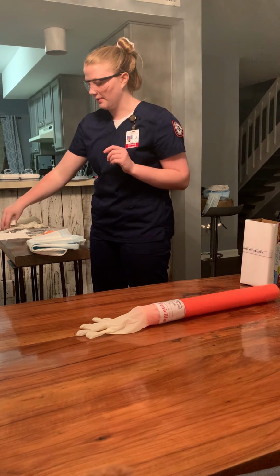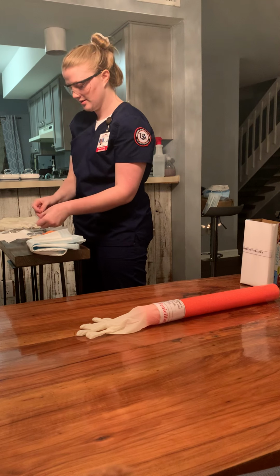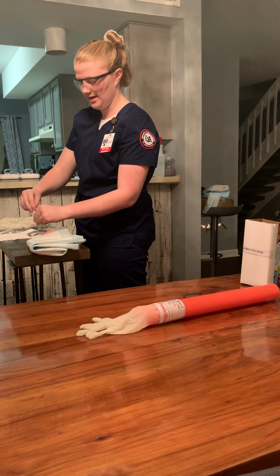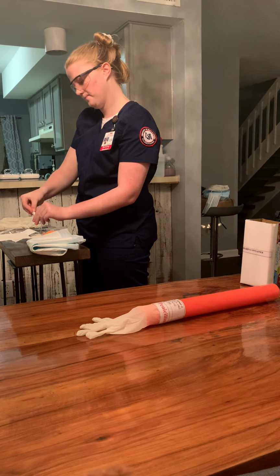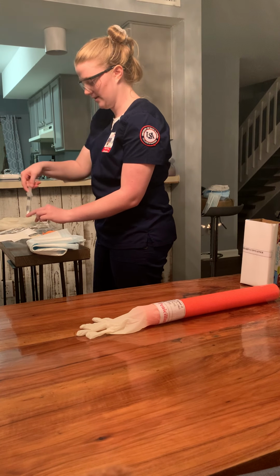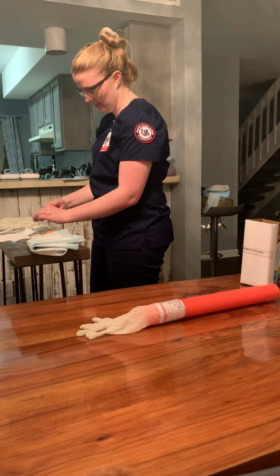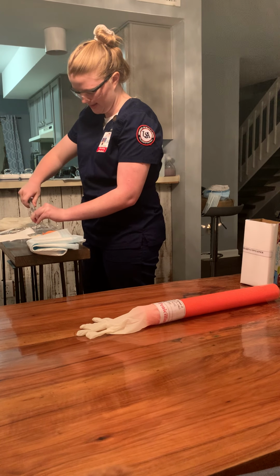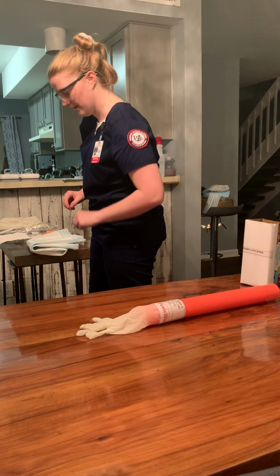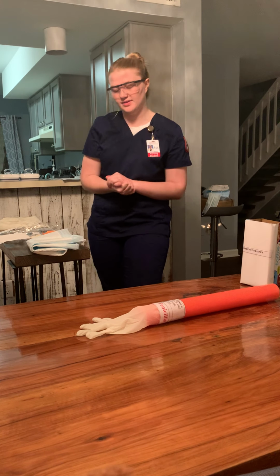And so now I would take my alcohol swab, dispose of that, grab my Luer lock on my saline lock and clean it with an alcohol swab really well. And then I would dispose of that, grab my saline syringe and apply it. And then I would just lay this back down and I would loosen the end cap and just leave that there.